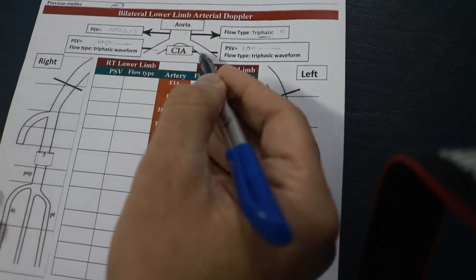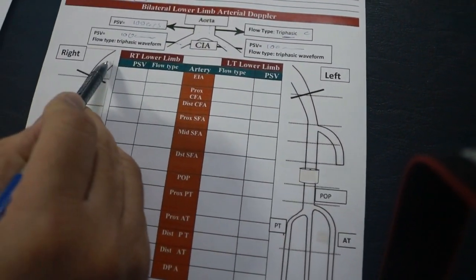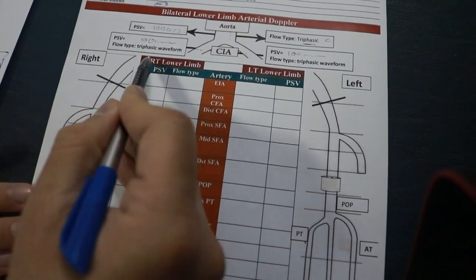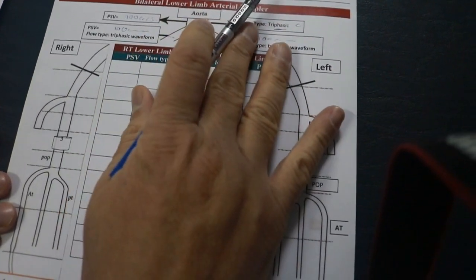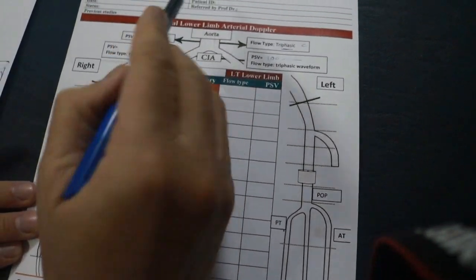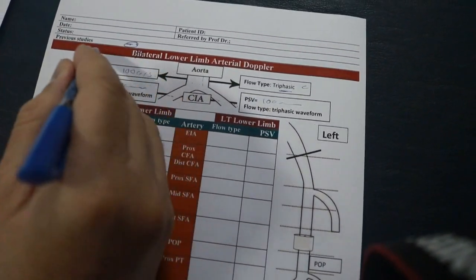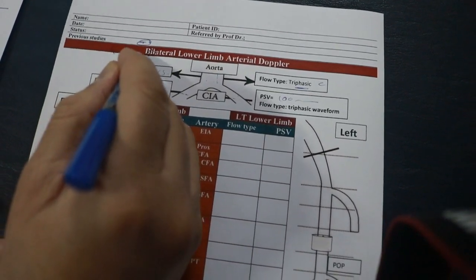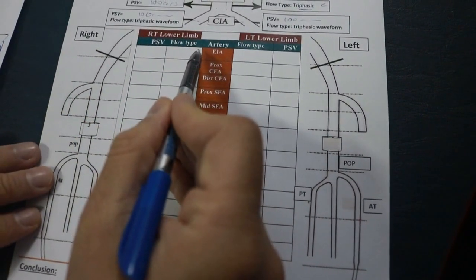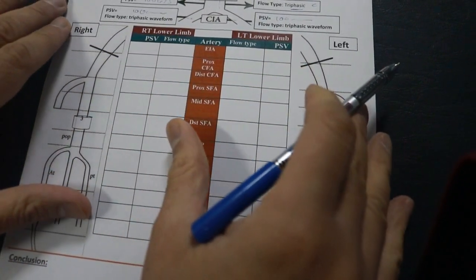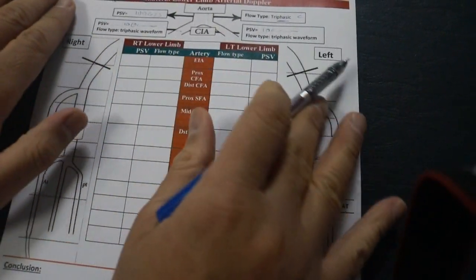Jump directly to the common femoral on the right side. We check the right side but we did not check the left side because the examination was not bilateral. Our examination was right lower limb arterial doppler. Here we create this format.